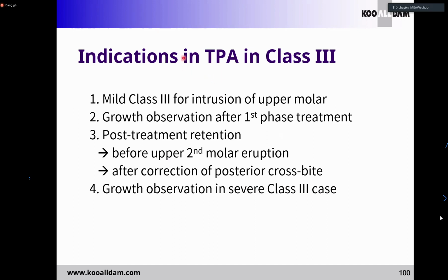So the basic idea in using TPA is how can we assess the upper first molar condition in mild class 3.